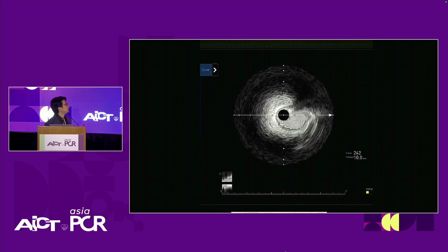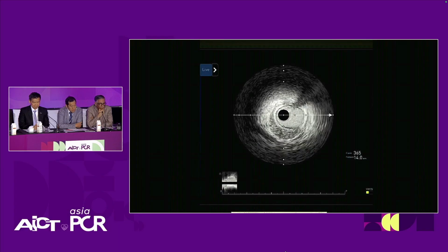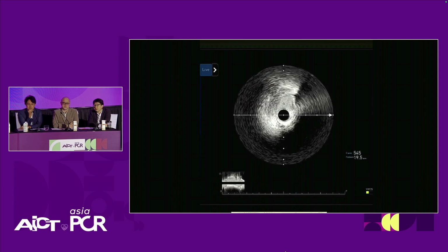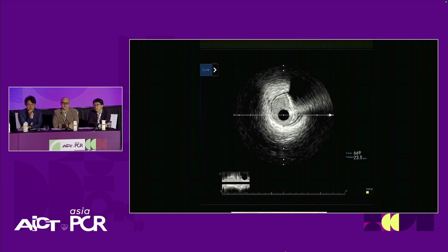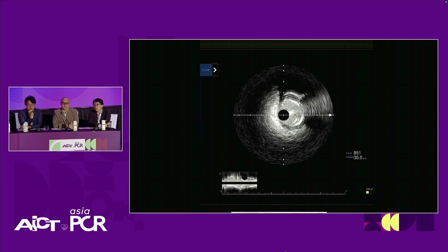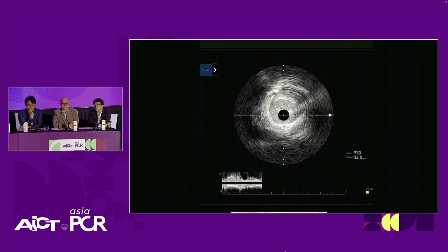Thank you. So far looking pretty nice distally. We're starting to see maybe a little bit of perivascular hematoma, and you can see some calcium modification, especially where the wire bias was. You see a luminal gain, as well as some concavity from the rota burr, probably. Over here, the wire bias is not so favorable as there is eccentric calcium, so not much modification.